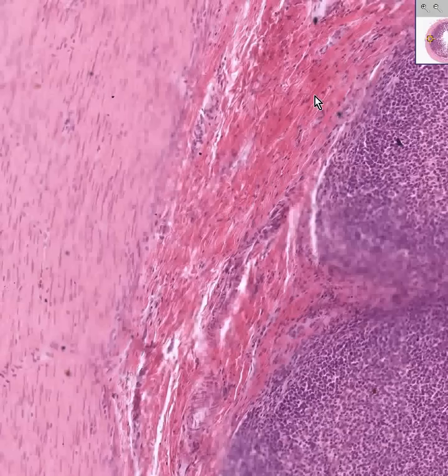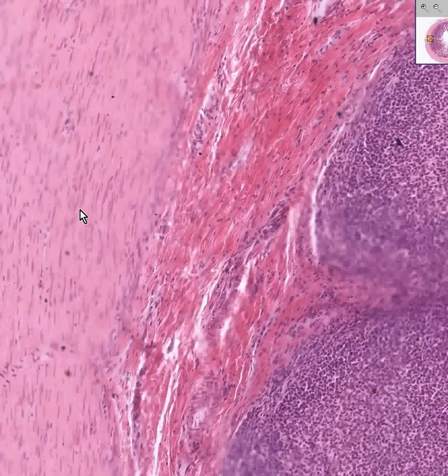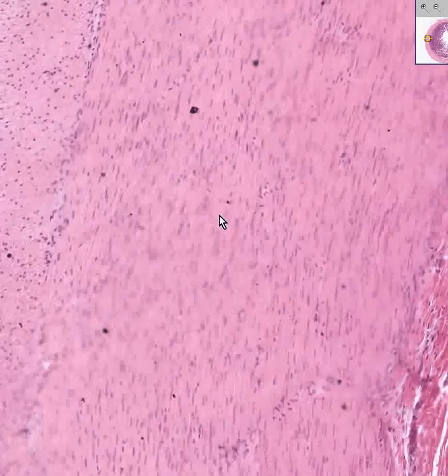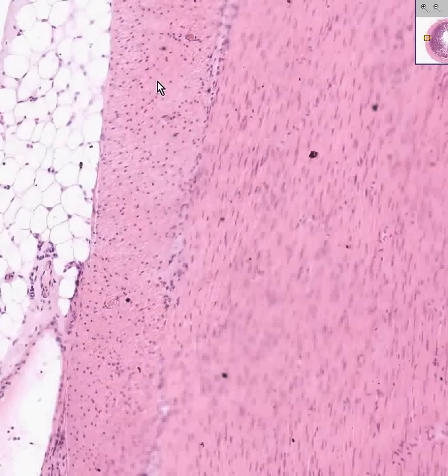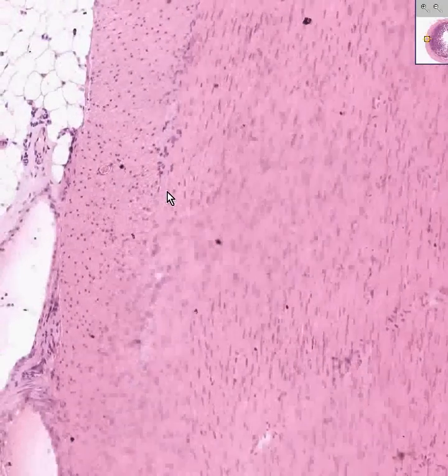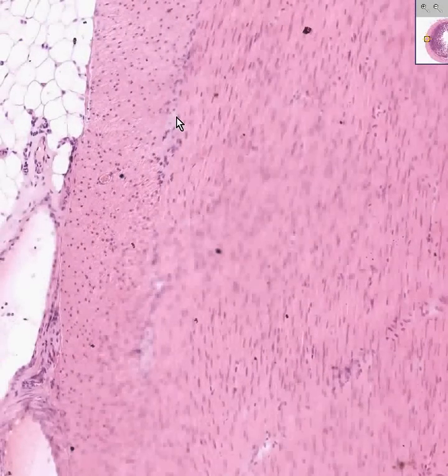Note how easy it is to confuse spindly fibroblasts of submucosal connective tissue with spindly nuclei of smooth muscle cells. Only a trichrome stain can solve the difference in many cases, because collagen will stain bluish-green and smooth muscle fibers won't. These are circular fibers because they are spindly when we cut the intestine transversely to the axis, and these are the longitudinal outer fibers. Occasionally you'll see little neural or ganglion-looking cells between the longitudinal and circular layers, which represent the myenteric plexus.